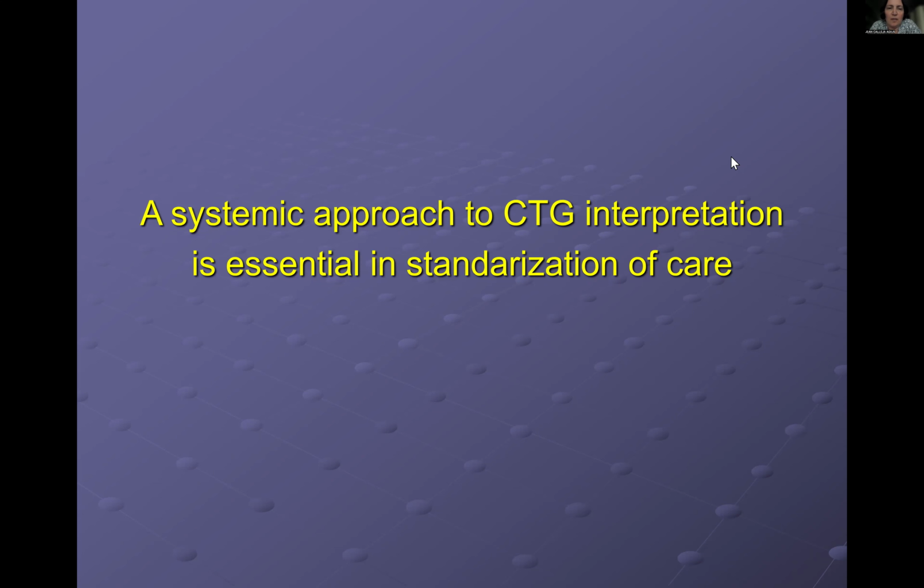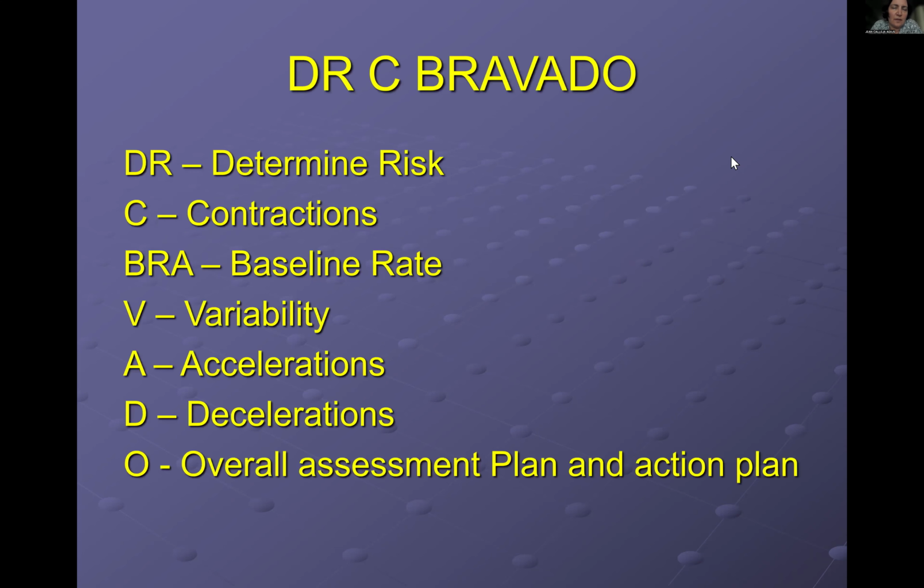Okay. So what I'm going to be talking to you about is this mnemonic, it's called DR C BRAVADO, okay? And it's a mnemonic, as you can see, where the DR, the doctor, you start off by determining risk. So the lady who has come into the delivery suite, is she low risk or high risk? The C is the contractions.